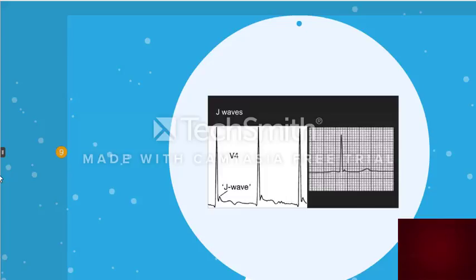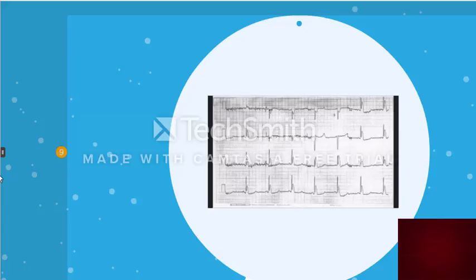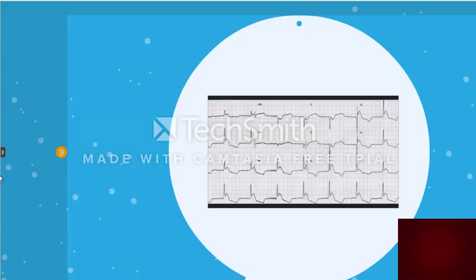All right. So let's have a look at this ECG. This is a pretty classic hypothermia ECG. I know it's old and a bit grainy, but this is just a really, really good example. You can see the Osborn waves, they're prevalent. You also can see this huge amount of artifact in the ECG, and where do you guys think that's coming from? That's right, it's coming from shivering. So when your patient is conscious, expect to get an ECG where somebody is shivering, where everything doesn't always look so great, all right? So let's have a look at this next one and take a minute and decide what you see here.